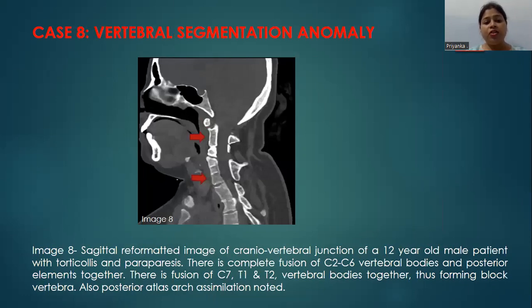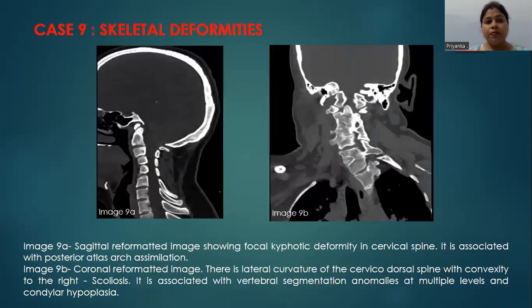This case had vertebral segmentation anomalies. It is a case of a 12-year-old male who presented with torticollis and paraparesis. In this image, there is complete fusion of C2 to C6 vertebral body and C7, T1, and T2 vertebral body forming block vertebra. Image 9A shows focal kyphotic deformity in the cervical spine, and image 9B shows a lateral curvature of the cervical dorsal spine with convexity to the right, suggestive of scoliosis.